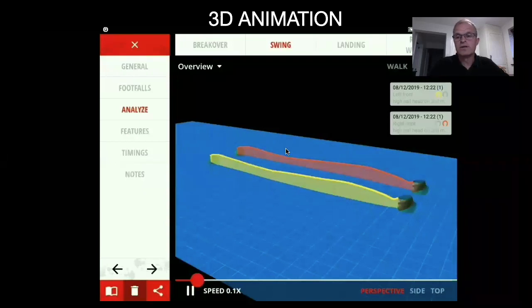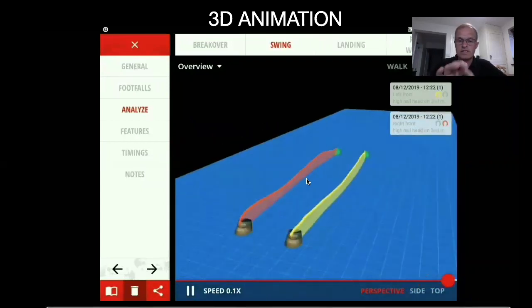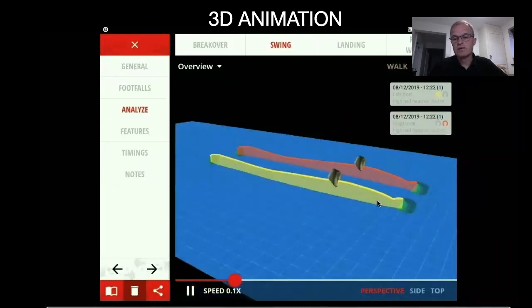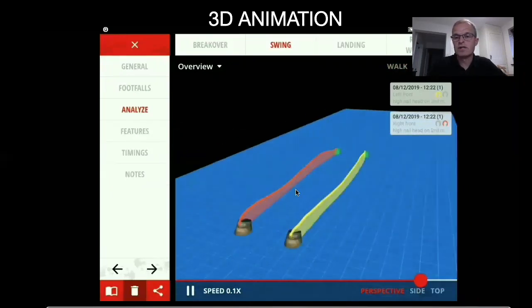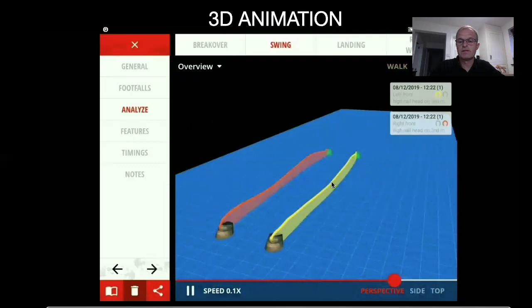The cool part, and this is what a lot of my owners like to see, is the 3D animation. So when we just measured a horse, I'll go to the analyze button, and basically you can revolve it as with an iPad, and look at every part of the stride animation and analyze in 3D. This doesn't tell me an awful lot, but it does tell me if there's any deviation in the strides. But a lot of the time, owners love this part, because it actually does replicate what you see with your eyes, in their stride patterns. You can actually see this in the 3D animation.